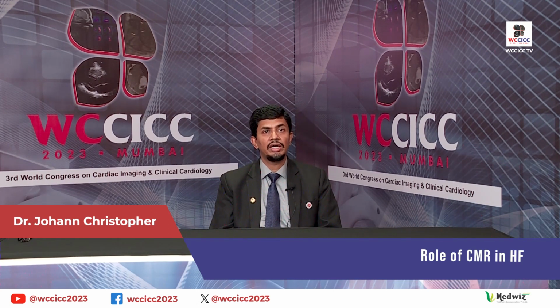Now, to detect heart failure is a clinical diagnosis. However, because of our gradually weakening clinical skills, it is important to augment clinical history and examination by other tools such as the ECG, 2D echo, and advanced modalities. After the initial diagnosis is made, the cardiac MRI adds a layer of security, a layer of reassurance. When we evaluate these patients, it integrates all the information which is there clinically, ECG and echo, and puts it on a platform that becomes easy to characterize these patients.